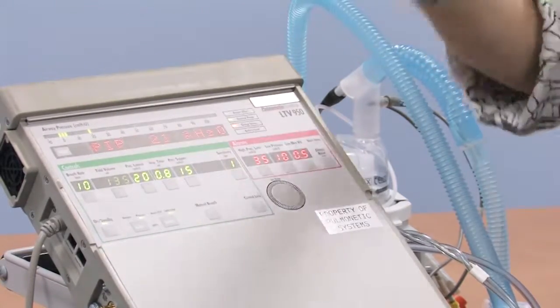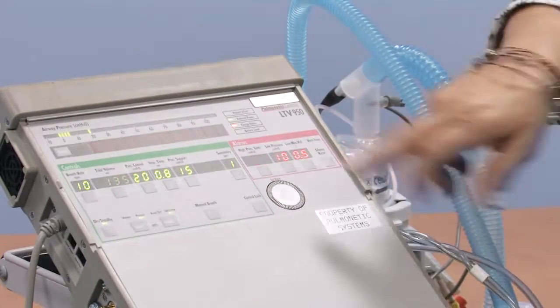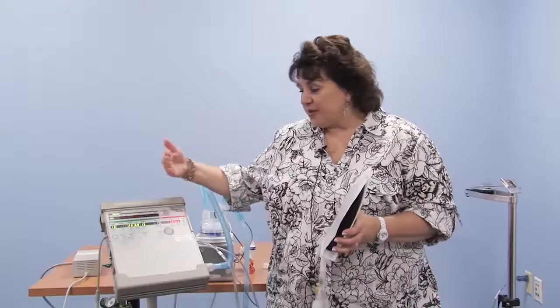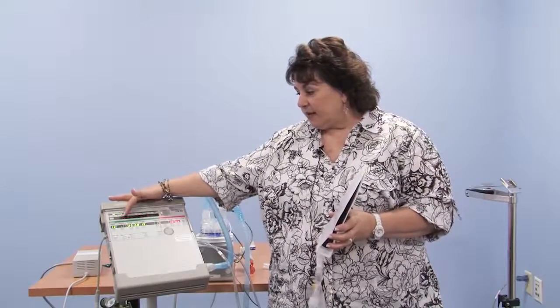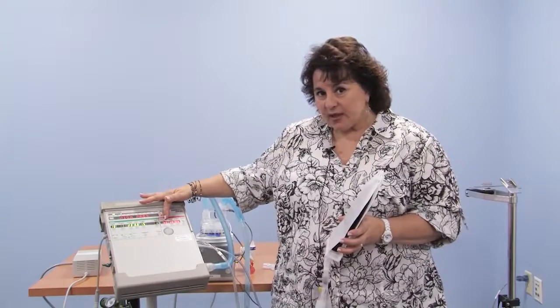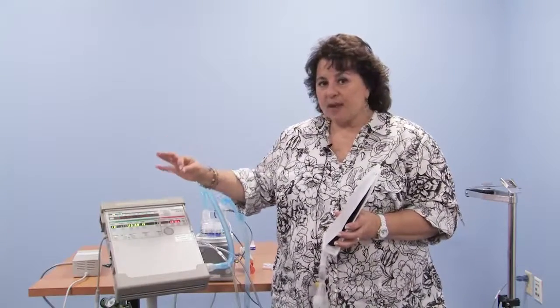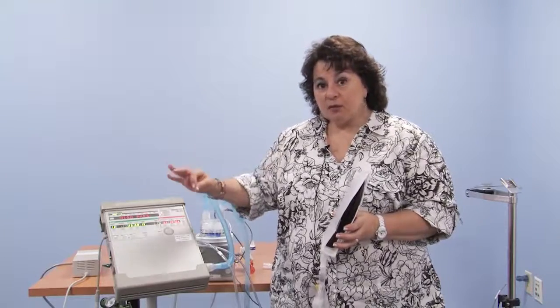If your child is coughing against the machine, you might see the pressure go way high and say high pressure, and the high pressure alarm is flashing at us. So there are different reasons in which the numbers will change. Whenever an alarm happens, it's visual and audio. The reason why you didn't hear anything right now is because there is a very nice feature on the LTV in which, for children that are very active, cough, turn around, yell at you, whatever, you can silence the audible to the high pressure alarm for 1 or 2 breath cycles before it starts beeping out loud at you, if you choose to have that feature on.